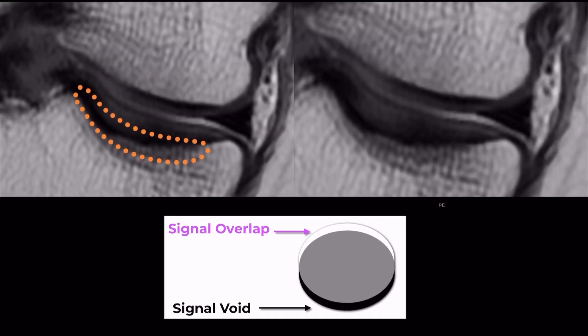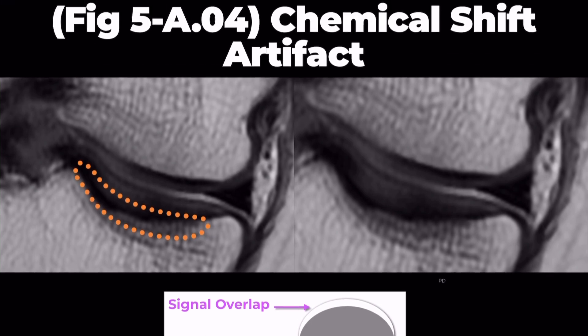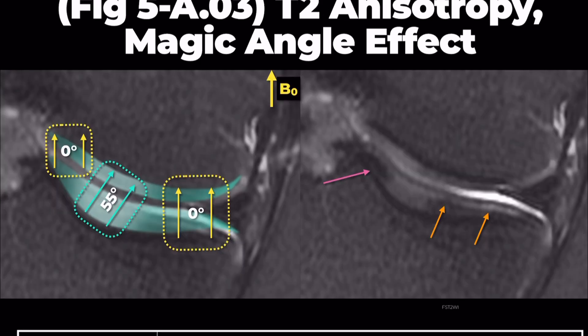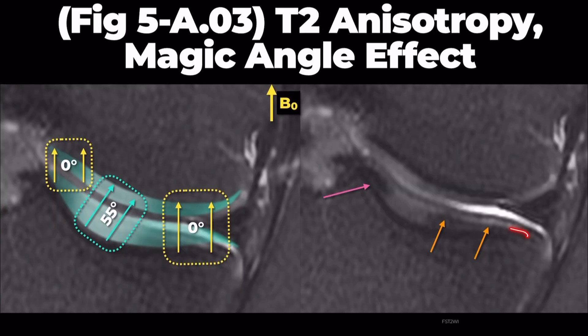We might overestimate the thickness of the subchondral bone plate, which in turn leads us to overestimate the depth of a cartilage lesion. The linear truncation artifact, indicated by the orange arrows, is also visible.